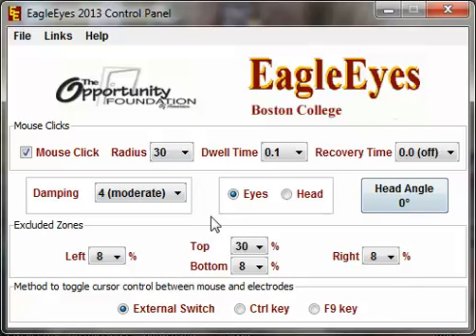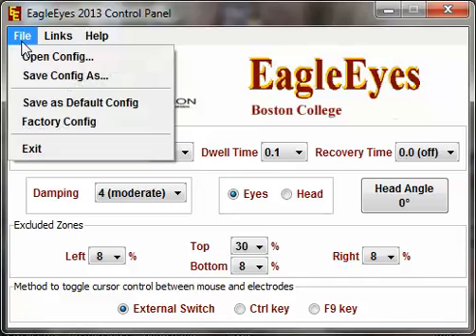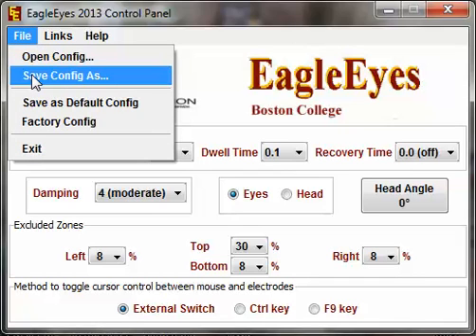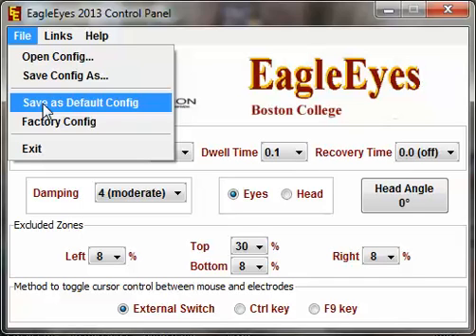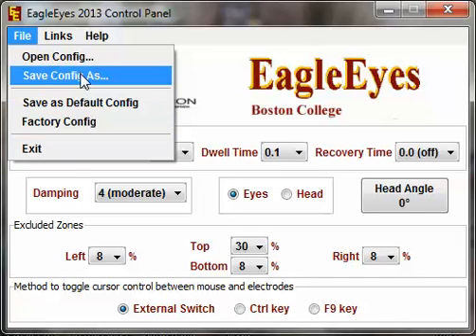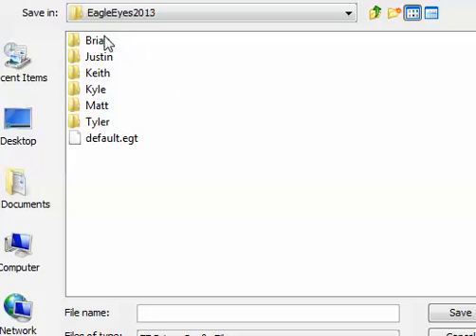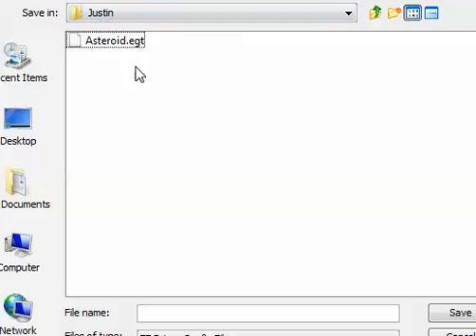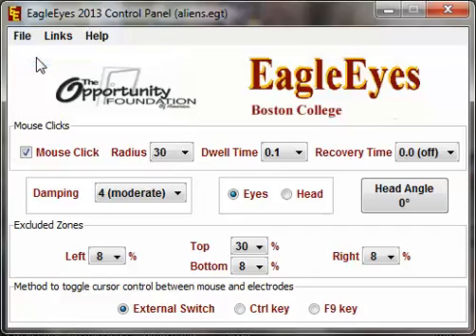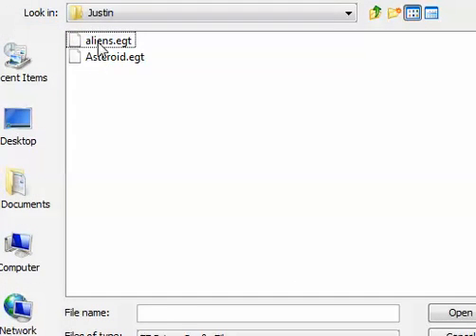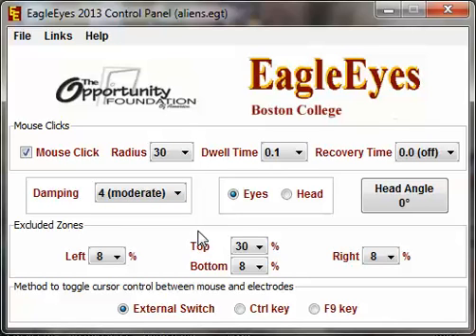Once you have all these settings configured, you don't want to reset them every single time. You can save configurations — save as default if you want the same settings every time, or restore to factory configuration. You can also save configuration as a new file, creating folders for different users and within those folders saving a game configuration for each game, since settings may differ per game. The next time you want to play, just open config, go into the user's folder, and click the saved configuration to load all settings automatically. Over time you can build a library of activity configurations for each user.